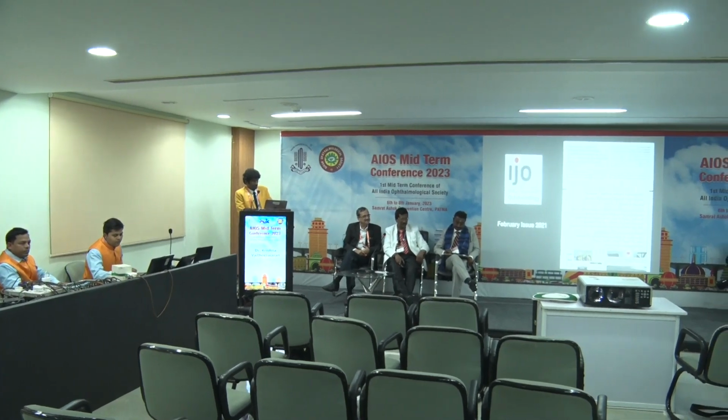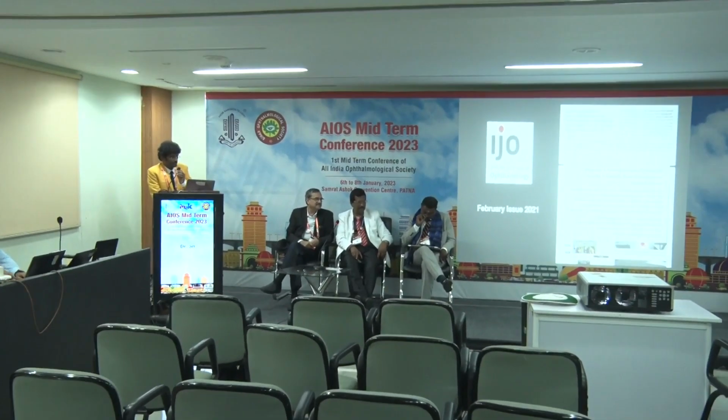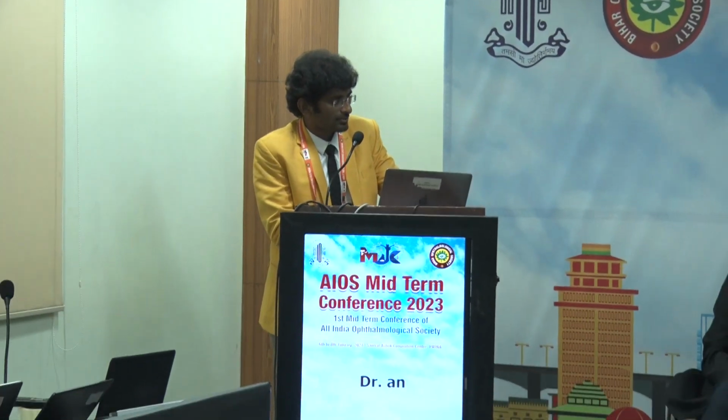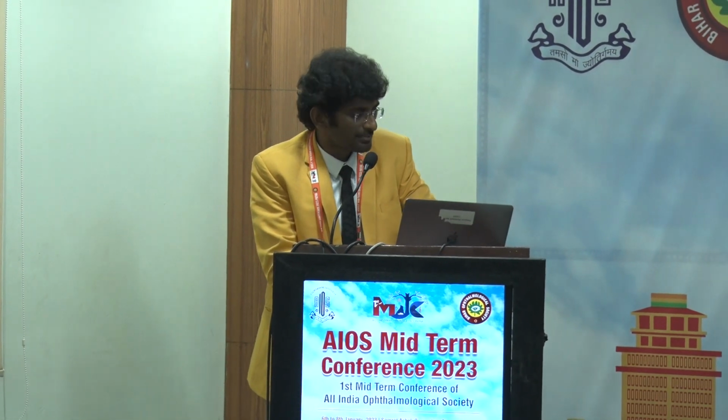Intelligence. So it started for me 3 years back with the local access network. It's called LAN, and it is also having a wireless connection too. This is one of our publications in the February 2021 issue, where we interconnected all the ophthalmic gadgets at our fingertips to export maximum data.